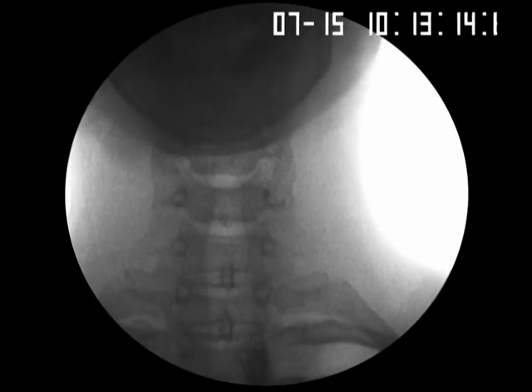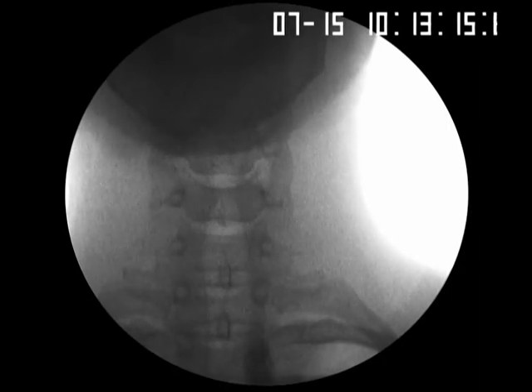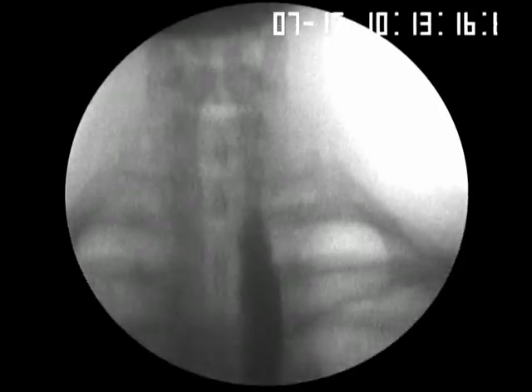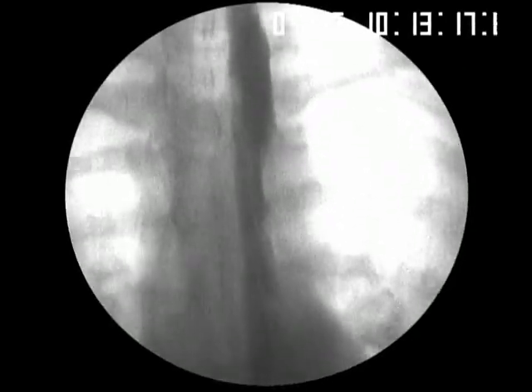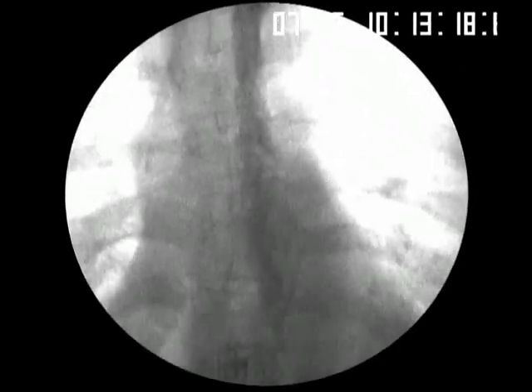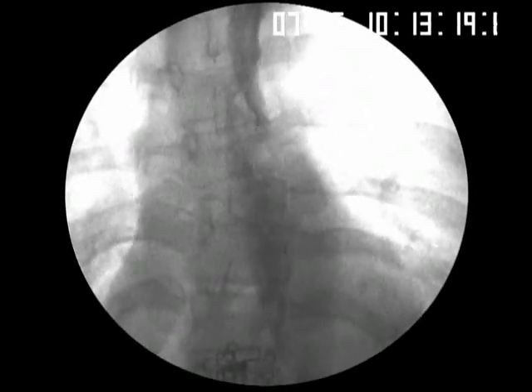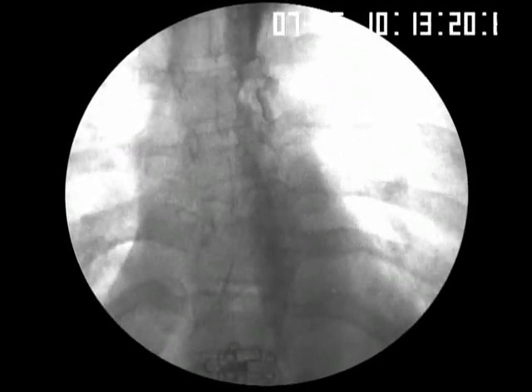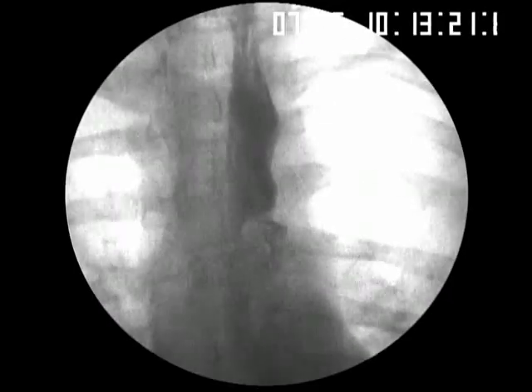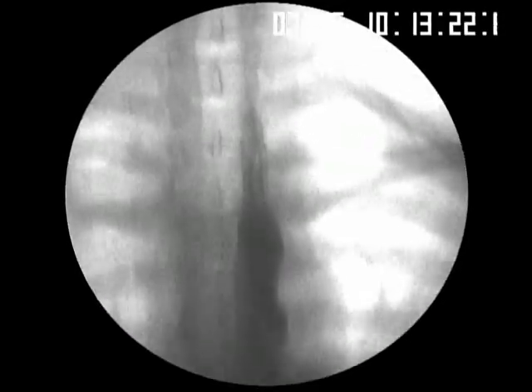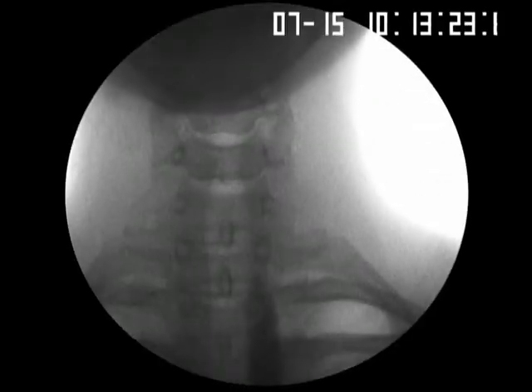Can we just go all the way down? Okay, thanks.